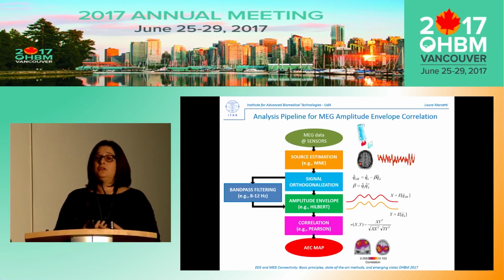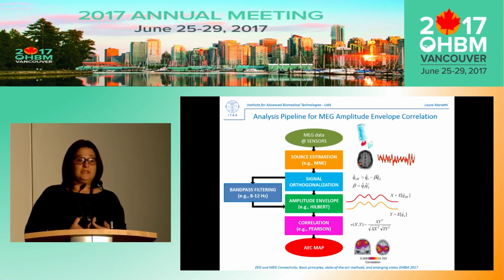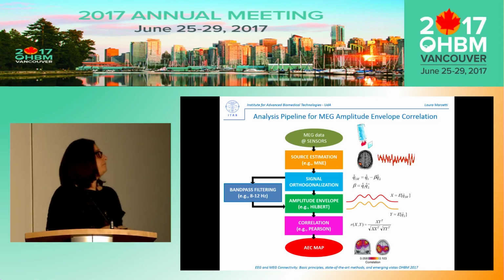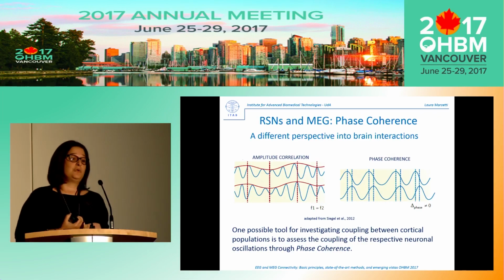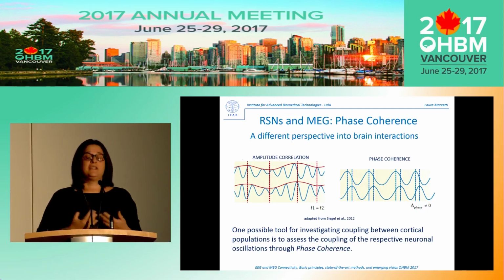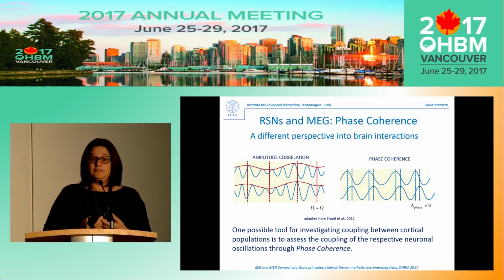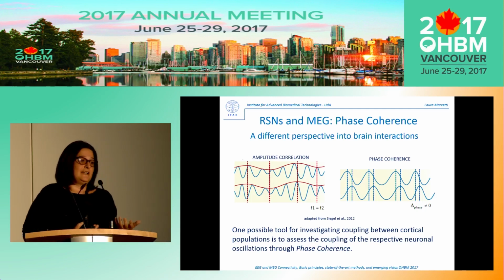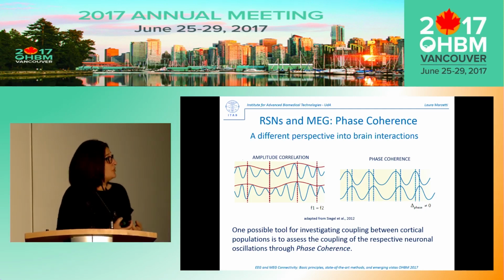Okay, and finally, you end up having the kind of maps that we have already seen, which are usually called, in the MEG domain, amplitude envelope correlation maps. But this is not the whole story of what you can get from MEG. It was nice to see, in 2010 and the immediately following years, that there was a kind of resemblance, because this made everyone confident that the fMRI results had some electrophysiological correlates, also by using non-invasive approaches.